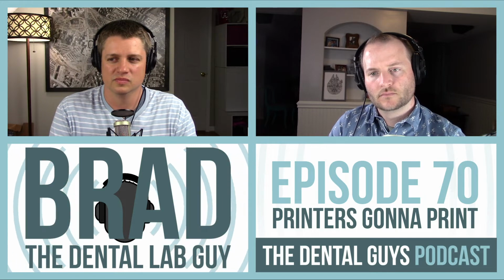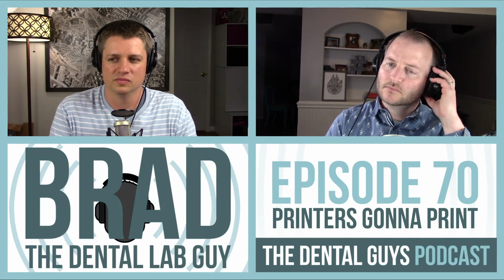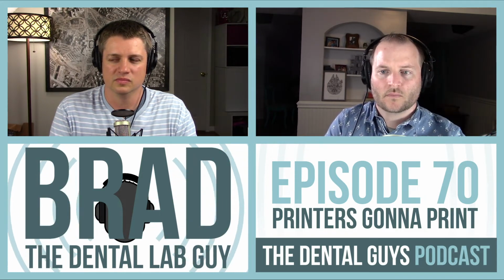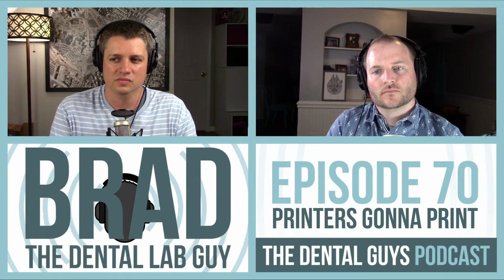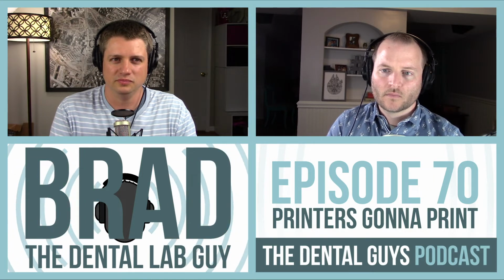You can't just print something. It has to be supported as it gets printed. And there's a pretty big learning curve on how to sprue to support that. But honestly, Wes, they're kind of push button little machines. You turn them on and go.